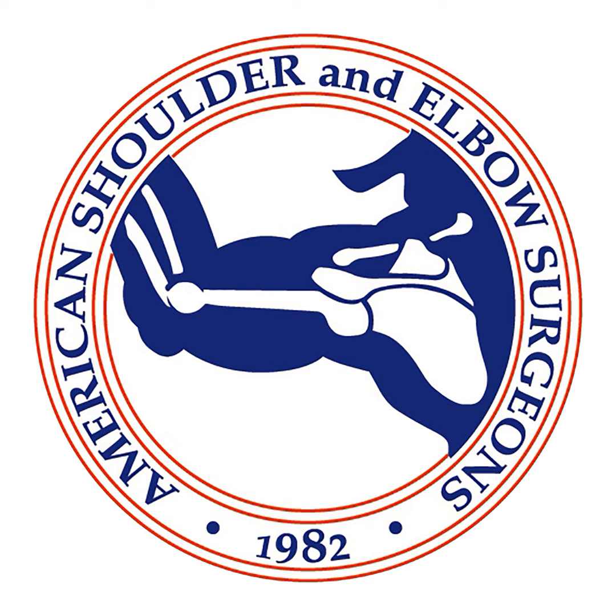So something that has that initial strength, but right as it grows into the tendon or whatever, as it incorporates, it gives up some of its stiffness and shares the load with the tendon. I totally agree. That's kind of my concern with these fully synthetic scaffolds, that I would like to see some long-term data on how they perform.